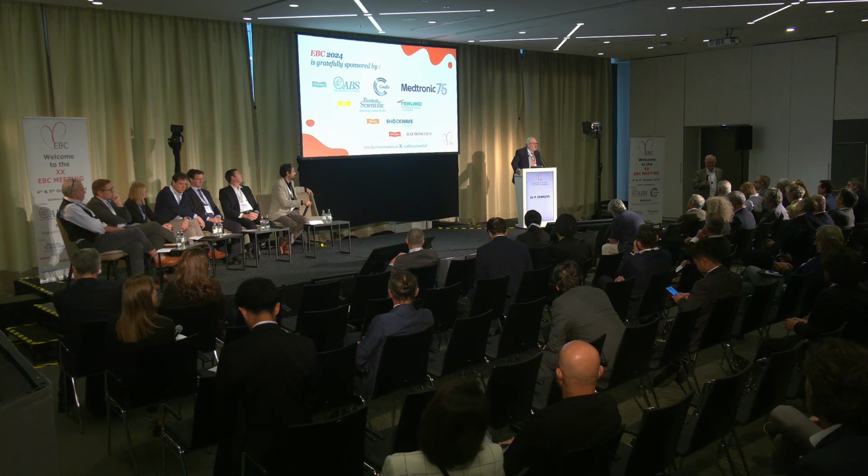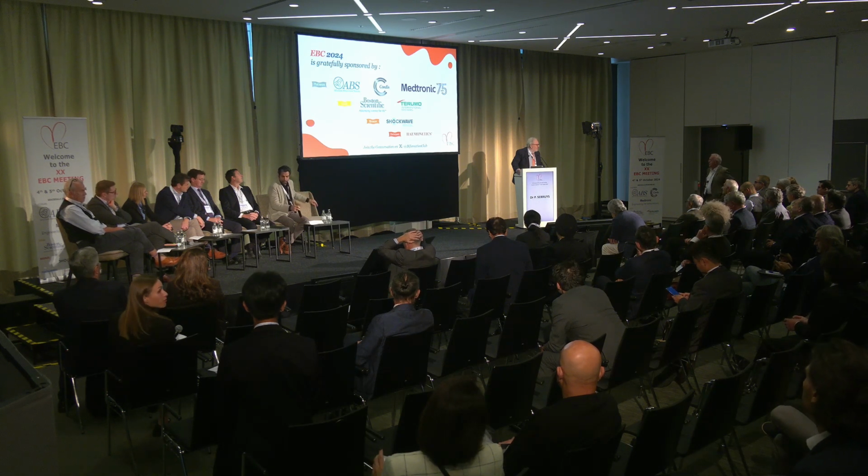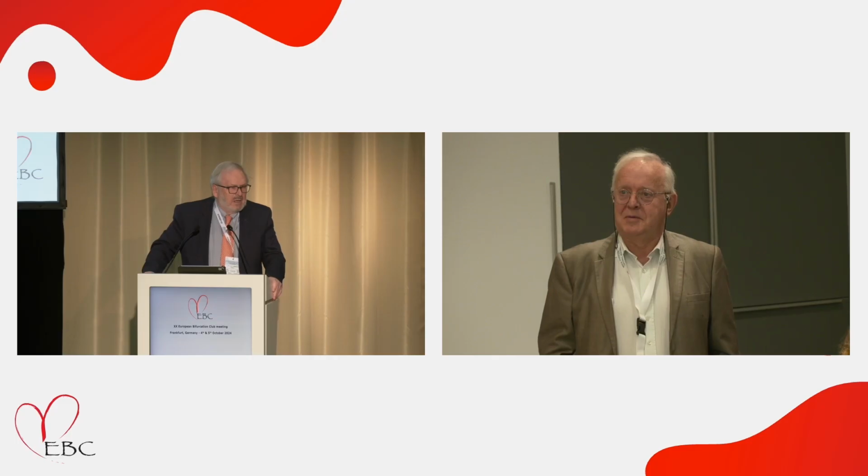Yeah, so I presume that now we'll see how to prepare the treatment of a patient with a CT scan only. Yeah, we have done that. If you remember, at PCR last year in Clinique Pasteur with Bruno Farah, we made the case completely with multi-slice CT scan in this institution, but we made the interpretation and analysis. And in that patient, we discovered a circular main stem, completely calcified, 360 degrees, with some calcium going in the circumflex and some calcium going in the LAD. We said to Bruno, live case for PCR, start immediately with lithotripsy. That's what he did. 10 activations of the lithotripsy, short because it was the main stem, and then stent, and it was done.